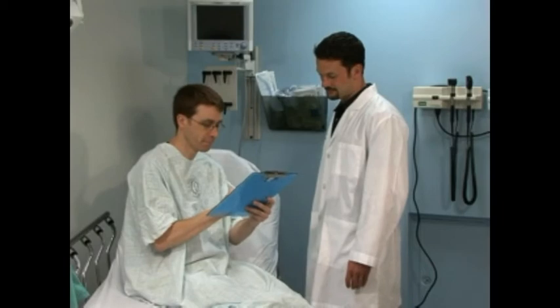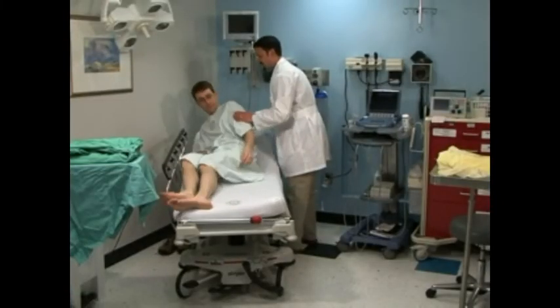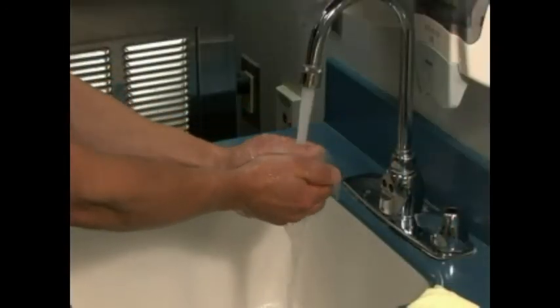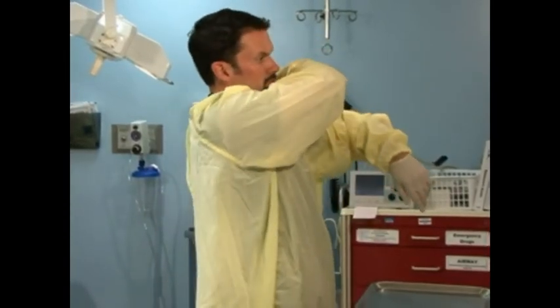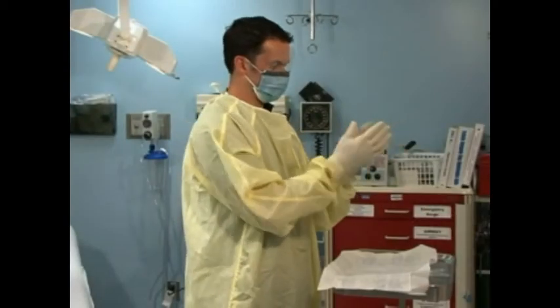Obtain informed consent by discussing the risks and benefits of this procedure, including pain, bleeding, and scar formation. Wash your hands with antibacterial soap before beginning the procedure. Protect yourself from exposure to bodily fluids, as many abscesses are under pressure. A face shield and gloves should be used.